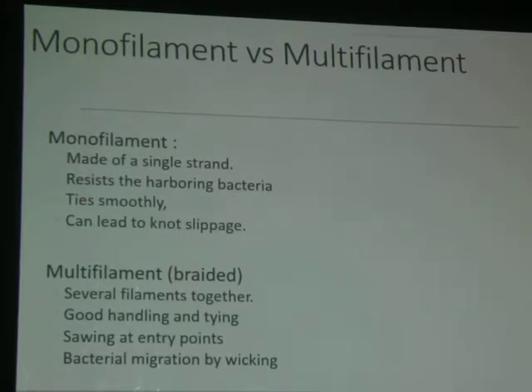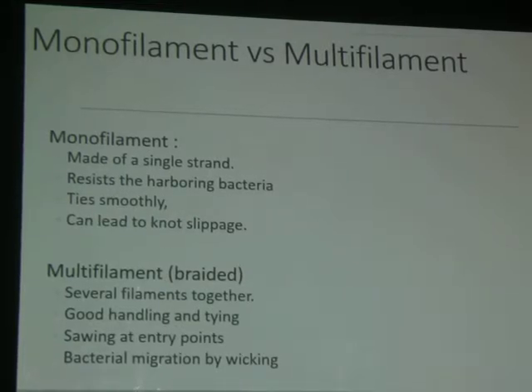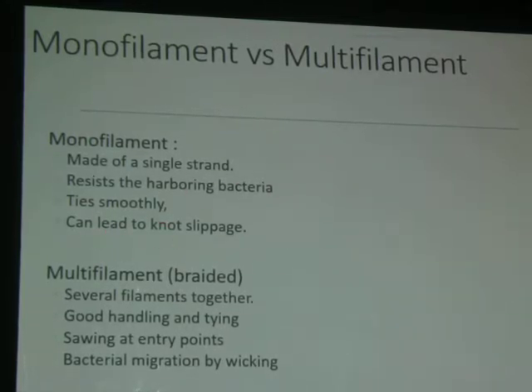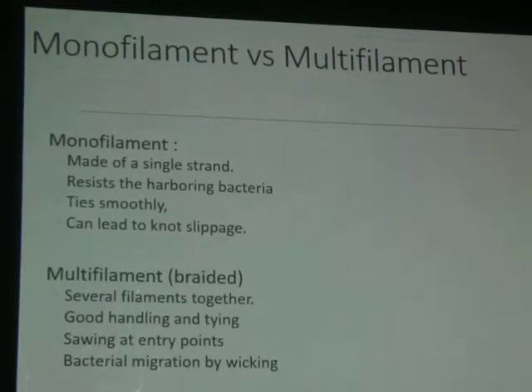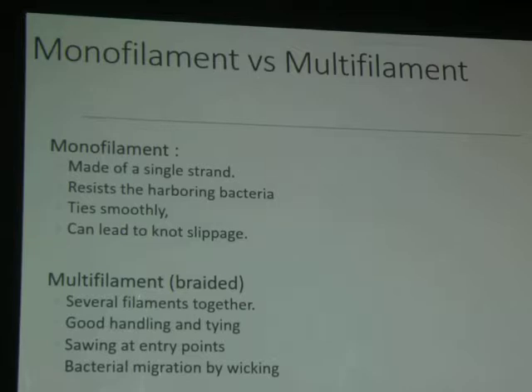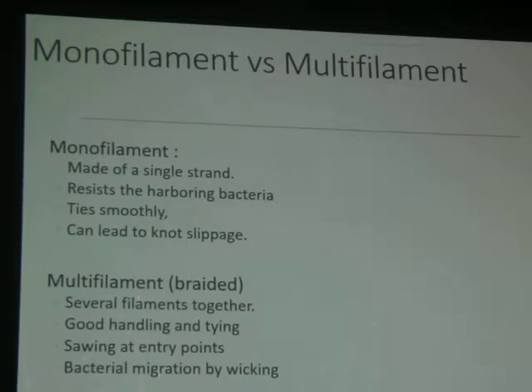Number two, it has no crevices، ما فيهوش حاجات صغيرة تدخل جواها التيشو fluids, and it does not harbor bacteria. It will not invite infection. But the bad thing about monofilaments is it can lead to knot slippage. زي ما هي بتتزفلط في التيشو بتتزحلق, it will not hold the knot. So I have to make more throws of my suture material to maintain a proper knot. And sometimes I cannot rely on it totally for secure, for instance, hemostasis or for a secure anastomotic suture line.